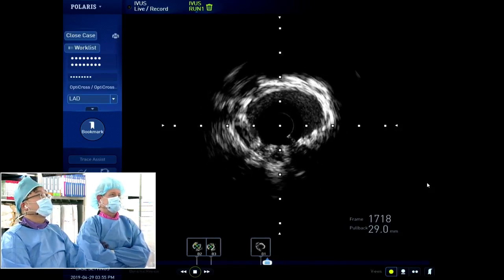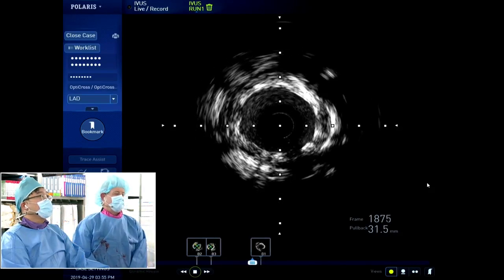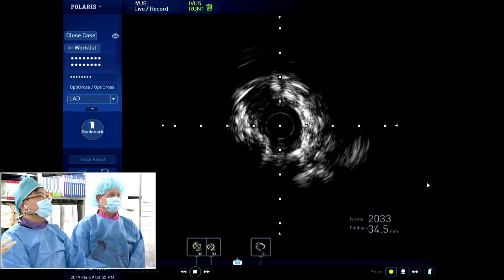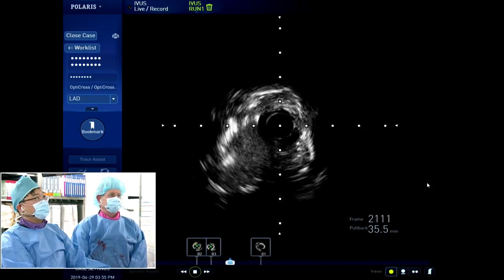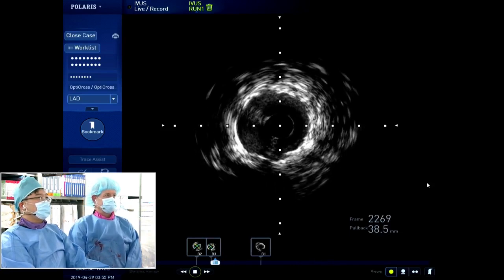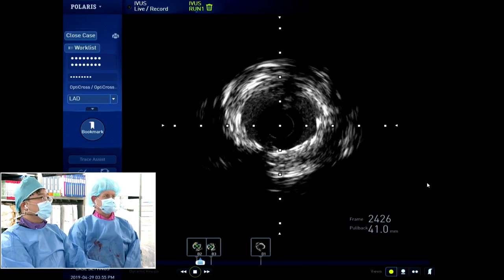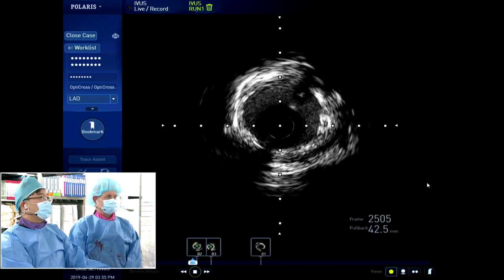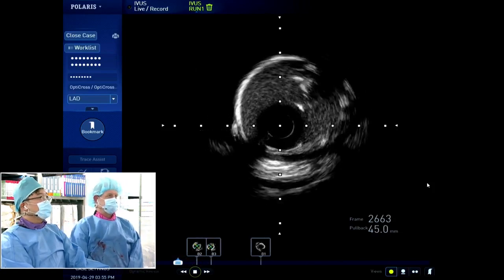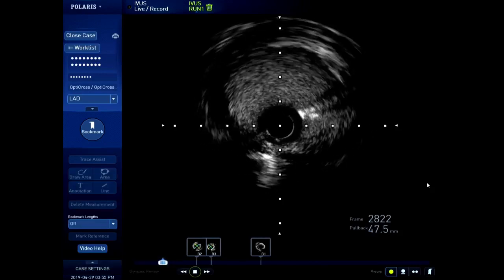And come here. This is proximal stent and circumflex. This is left main and circumflex coming. And this is an ISR lesion, relatively small stent, maybe underexpansion. Its mechanism is ISR. MLA is maybe 5 or 6 more. And the left main shaft is a relatively free region.